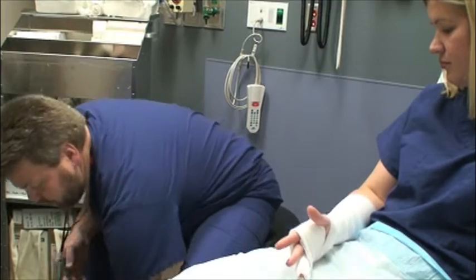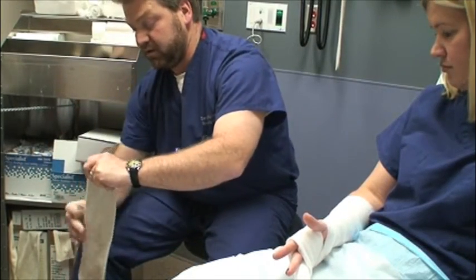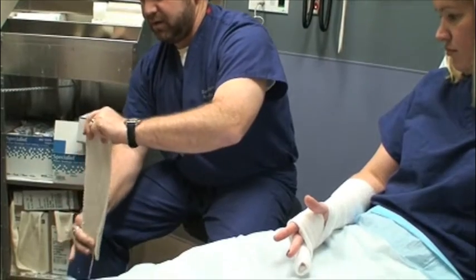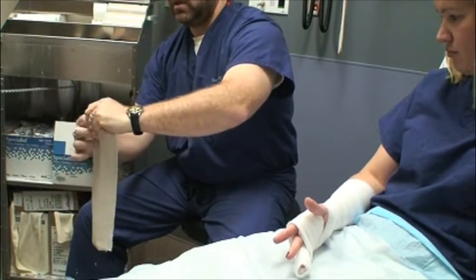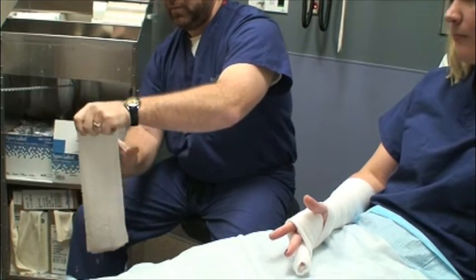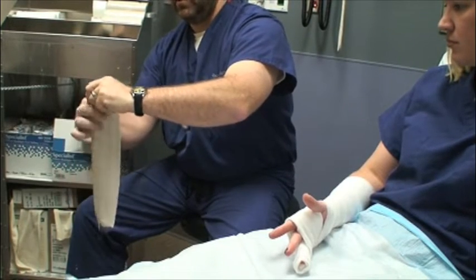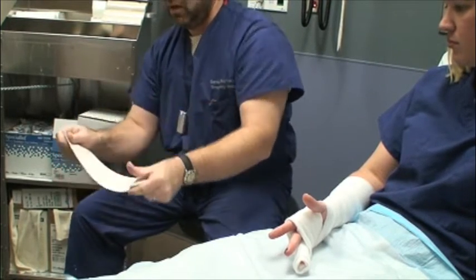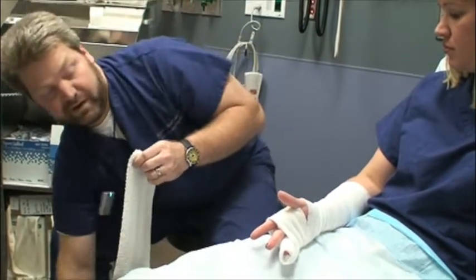I like to use hot water, but some people will use room temperature water. Dip it, get it fully wet, then use your fingers to mold the strips together and get the extra water out. You don't want to squeeze every bit of water out because you want some water in there to keep the plaster malleable — if you squeeze too much you actually get a lot of the plaster to come off, so you don't want that either.